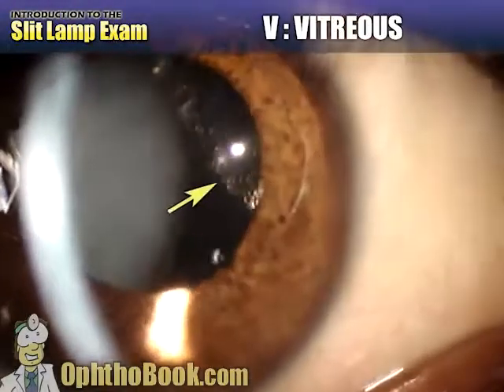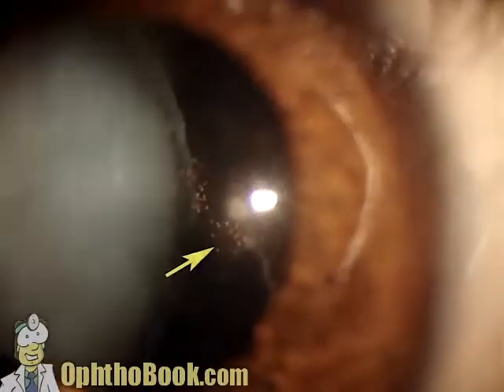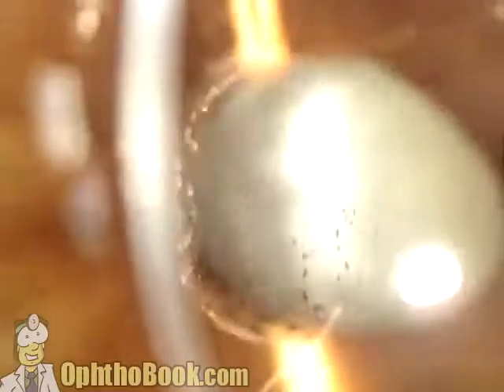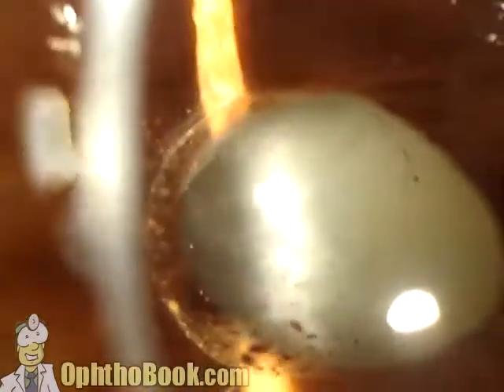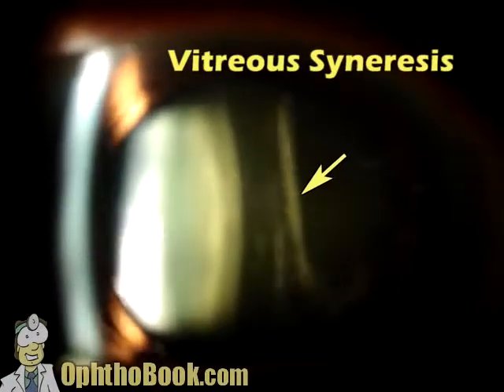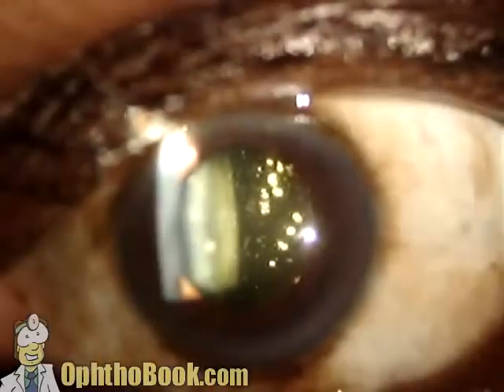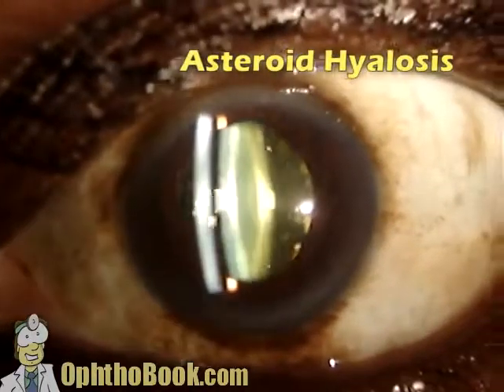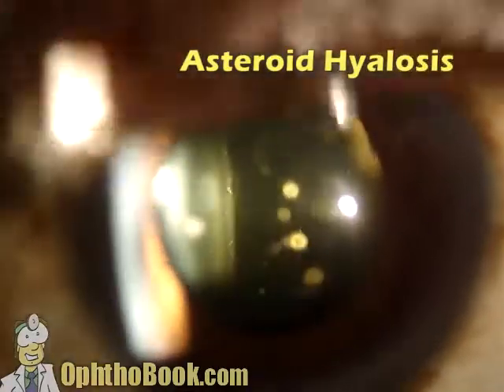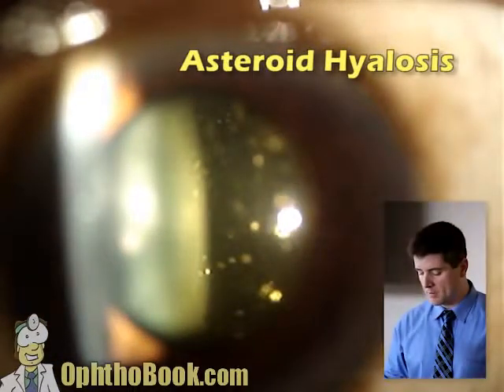This is vitreous coming around a dislocated lens after trauma with pigment stuck in it, making it easier to see that jello peeking forward in the front of the eye. Here's another case of vitreous — a big bubble right in the anterior chamber with little spots of pigment stuck on it, making this clear material easier to see. Normally when you look back there you'll see something more like this vitreous detachment — just a sheet back there like a curtain, the vitreous jello contracting. Finally, this is asteroid hyalosis: calcium soap deposits forming in the vitreous body, creating little floating stars. They look impressive but don't cause much visual problems and don't indicate serious eye pathology.